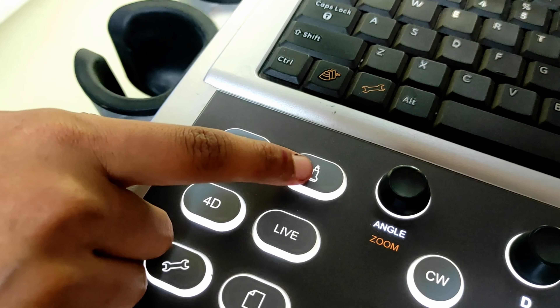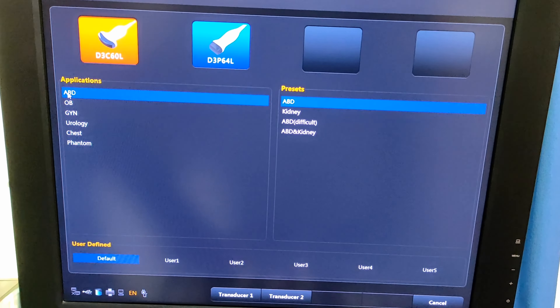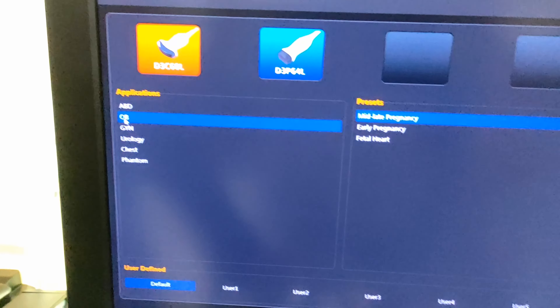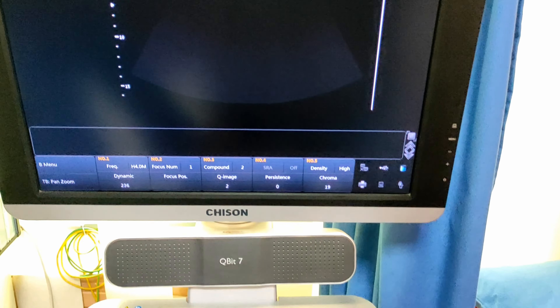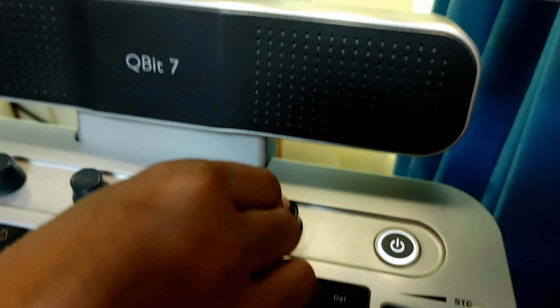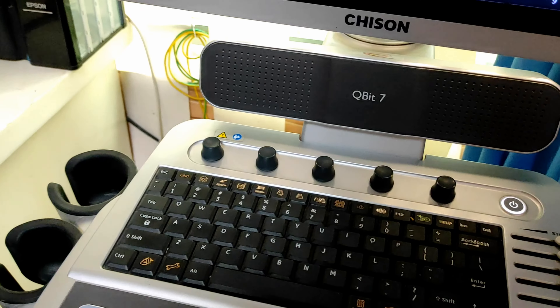This one is the probe button. Press the probe button and it will show you different types of examination systems: abdomen, OB, gynae, urology, and different types of examination systems. Now select OB by your enter button, and select transducer 1, not transducer 2. Now go to your gain button, which is next to your power button, rotate it and make the chroma value 9. It is very important — you should make the chroma value 9.